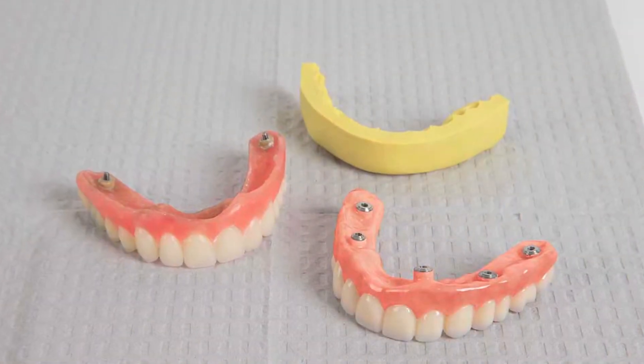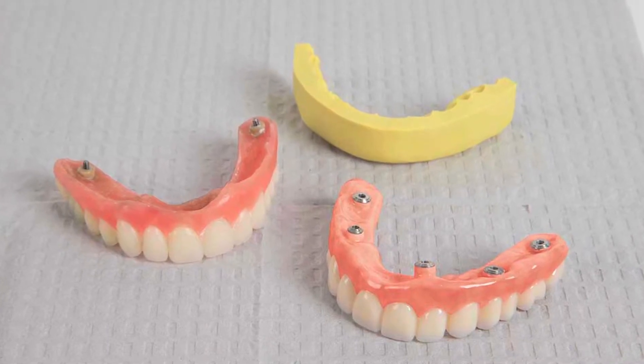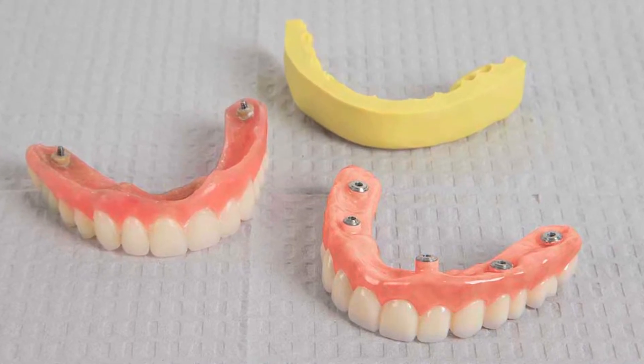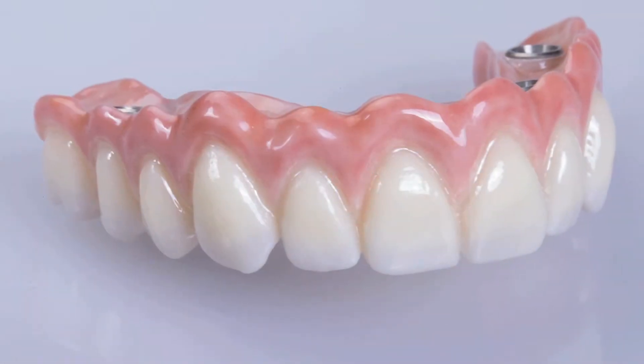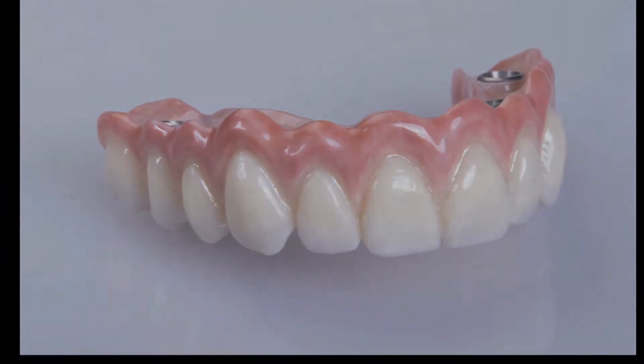Once confirmed with the putty index matrix, the finished product is sent to the doctor. The final prosthesis reflects the design approved by the doctor because it was preserved throughout the entire production process, ensuring that the restoration is accurate, aesthetic, and ready to be seated.